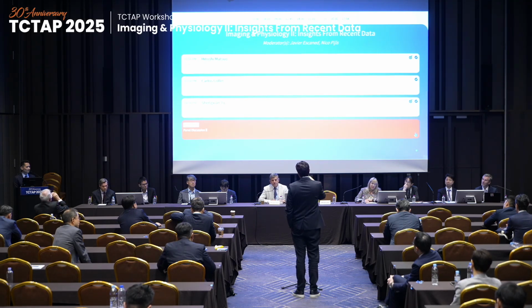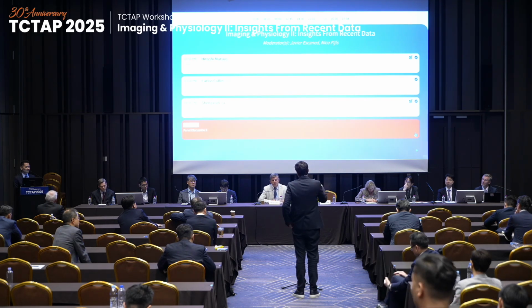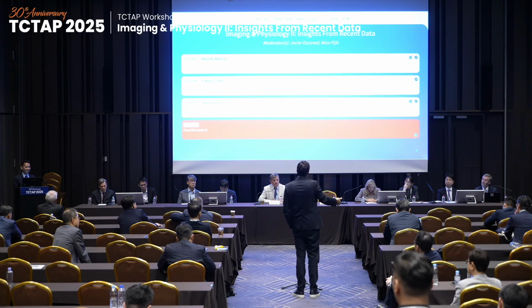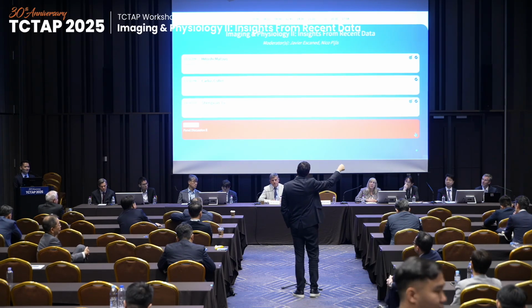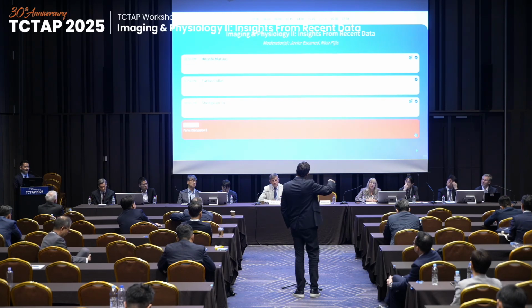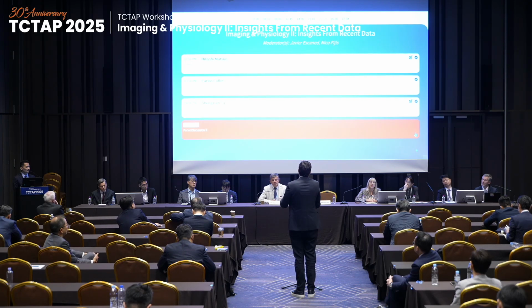What is exciting about this is that you can now predict what's going to happen. So we're now busy with this prediction element of the curve, that based on what you are treating, you can know what's going to be the flow at the end of the procedure. And that's kind of what I was referring to, the new use of physiology, which I think is quite important: to have a tool that can help you predict the outcome before you intervene on the vessel. So that's a bit. Okay, thank you.